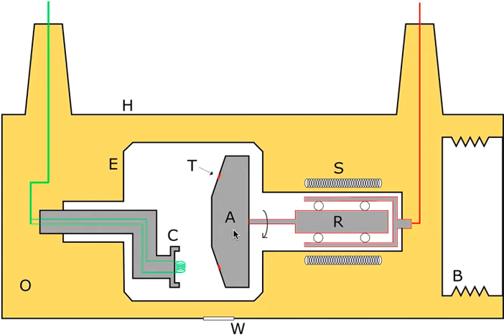On the anode, we have what's called the target. And you see that it's a little bit slanted, and this is for heat dissipation reasons.